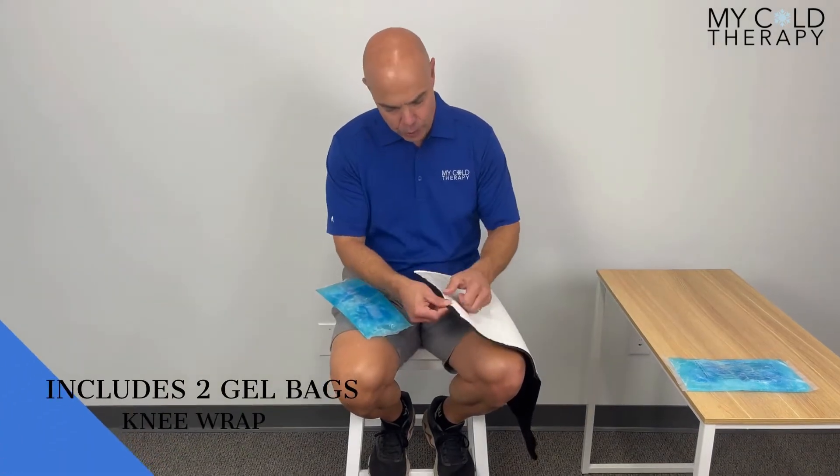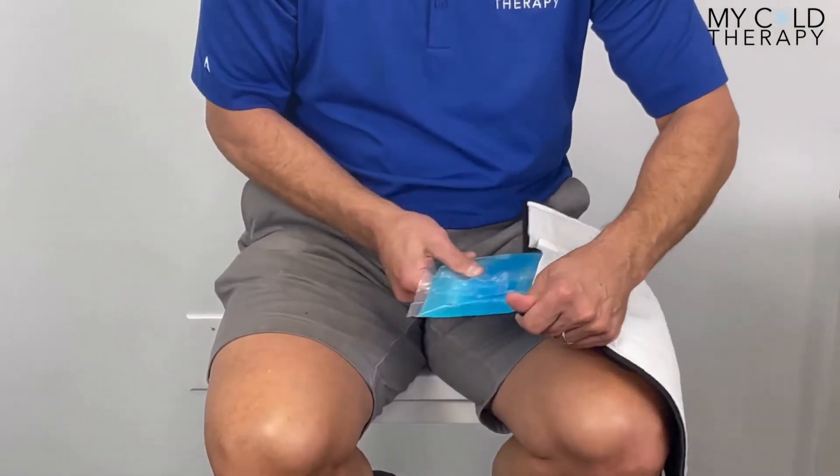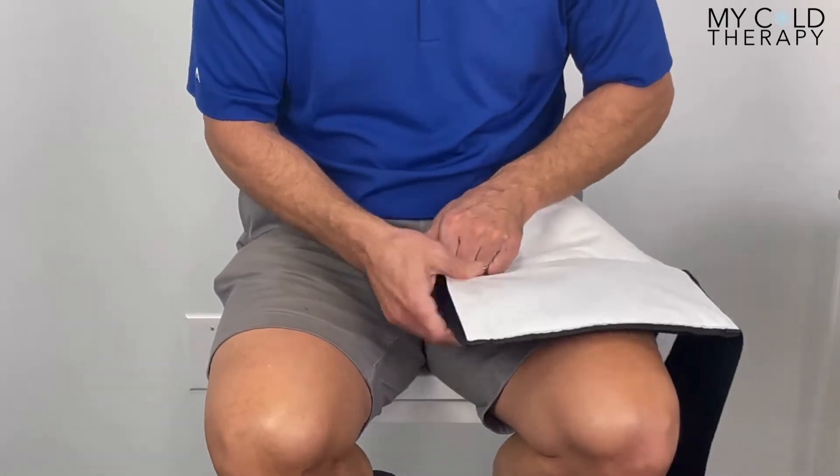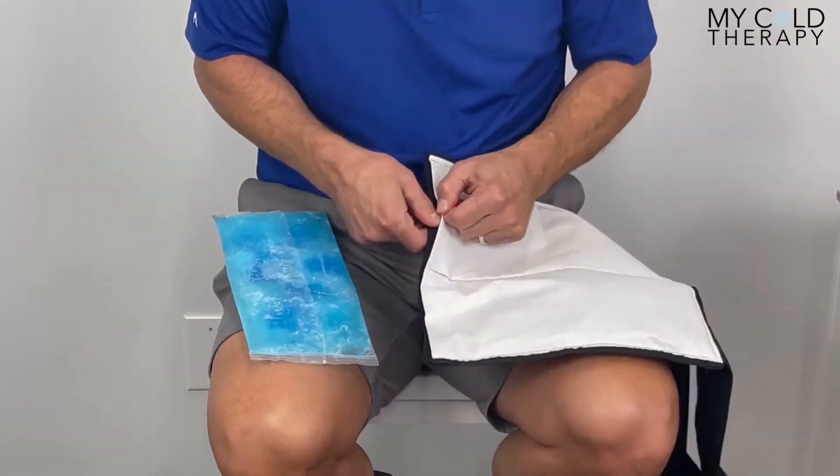The first thing we're going to do is insert the gel bags. You just pop open the pouch and they slide right in. This particular wrap takes two gel bags, so we're going to get them both in there nice and secure.